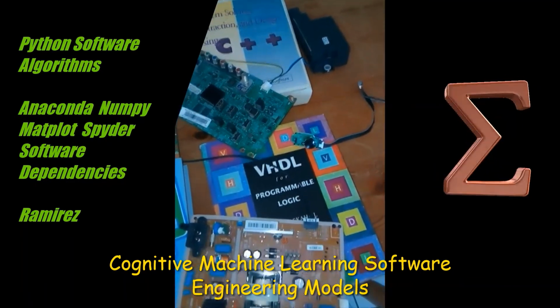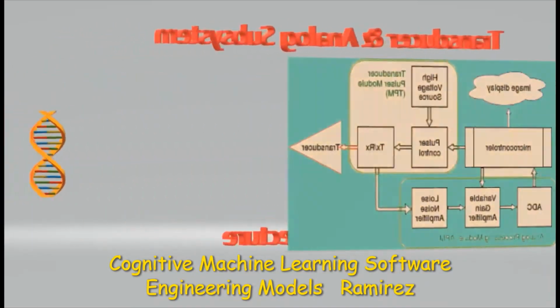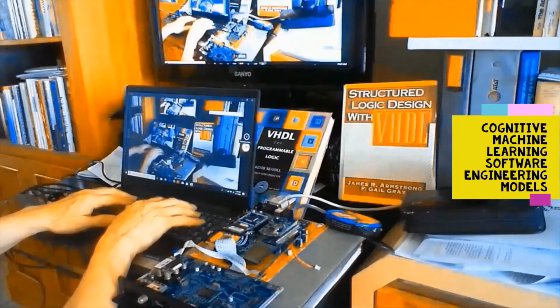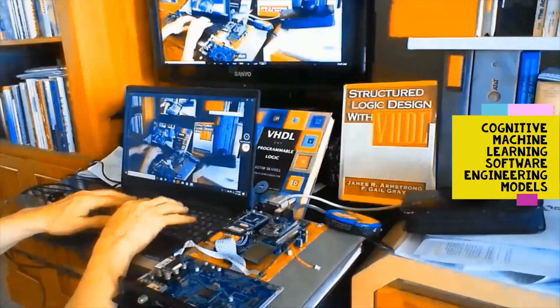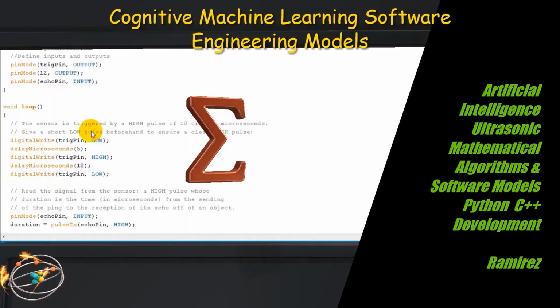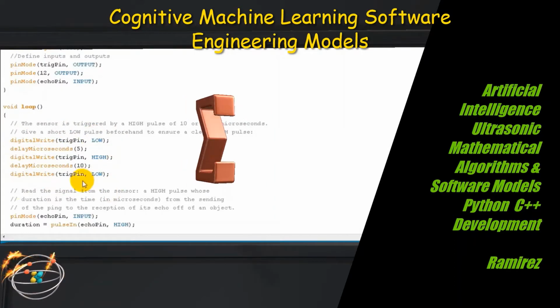The analog processing sub-module correctly processes the raw ultrasound electric signal while exposing all intermediary signals and exposing a digital output to the system user.